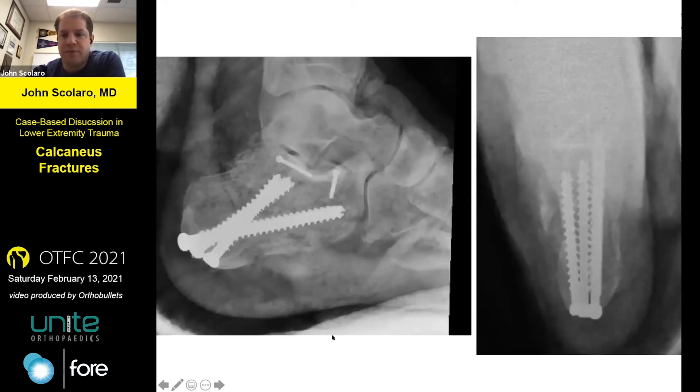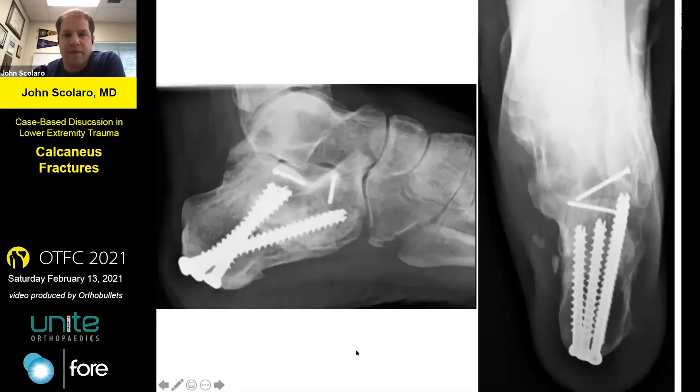Here are his initial post-ops. I probably should have taken out one of these fragments since it was in the open wound. Here he is at a year — his heel is well aligned. He's gone on to develop some subtalar arthrosis. Two screws just around where the primary fracture lines were that I could see through the sinus tarsi, and then screw fixation. They ended up doing okay, though he was complaining of some post-traumatic subtalar arthrosis.